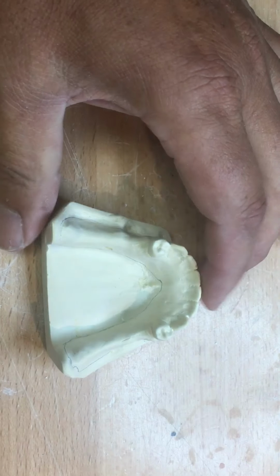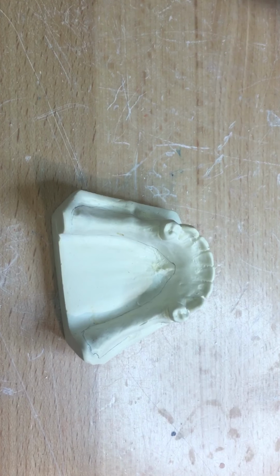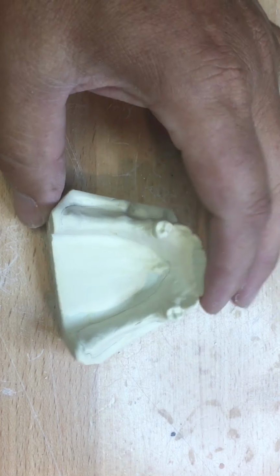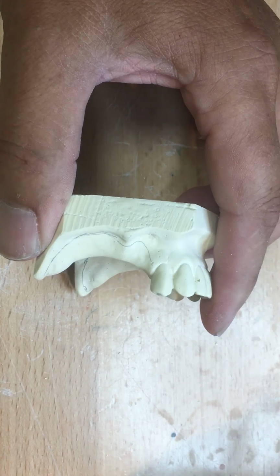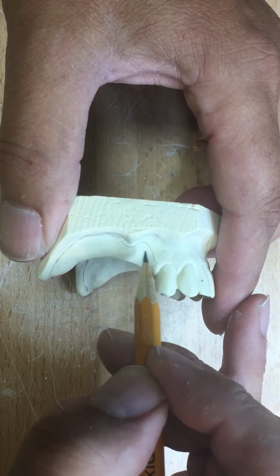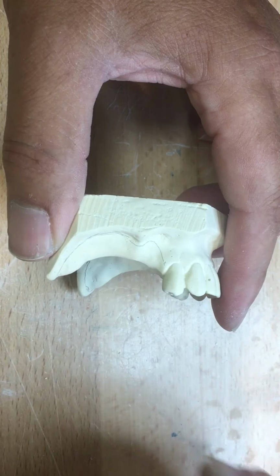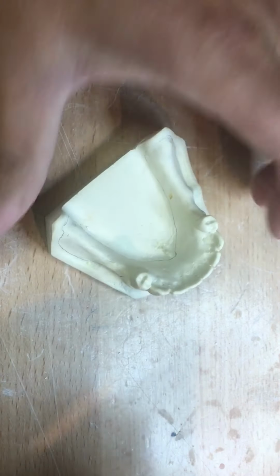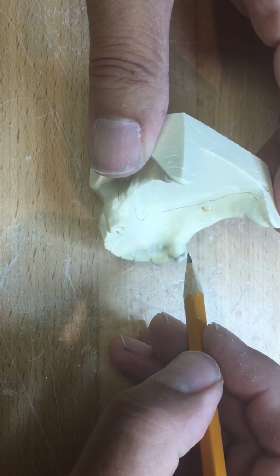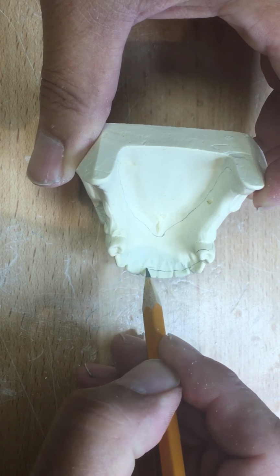So once I've outlined my major connector or the extensions of my occlusion rim, those extensions are going to be in light cure with a wax border for patient comfort. Especially as we're just guessing at the extensions of the free end. So we want to really err our judgment to put this border in wax so the practitioner can adjust it quickly. There'll be some slight guide planes in the major connector. This should sit like an acrylic partial on top of the cingulums above the height of contour of all the natural teeth.